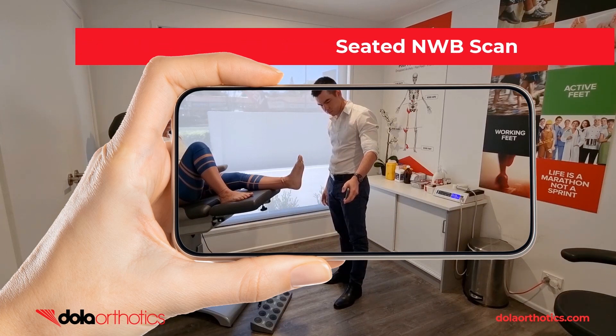Here is a demonstration of the iPhone being used to capture a seated non-weight bearing foot. Move the phone to capture all aspects of the foot and assess prior to submission.